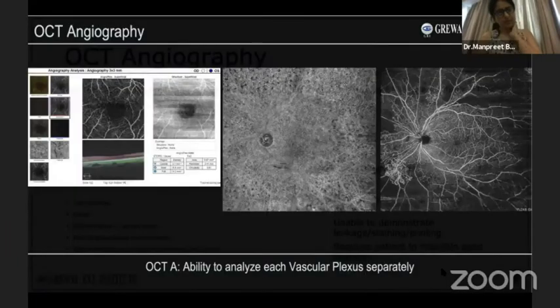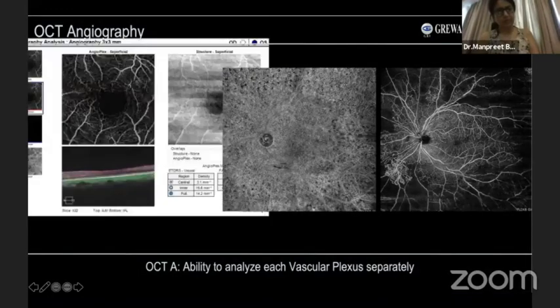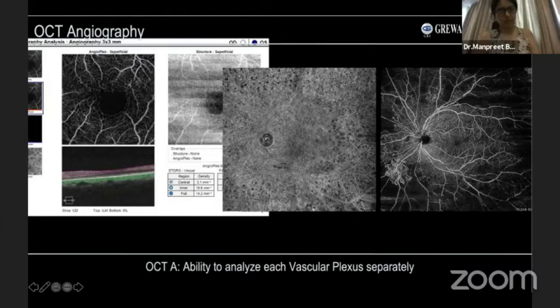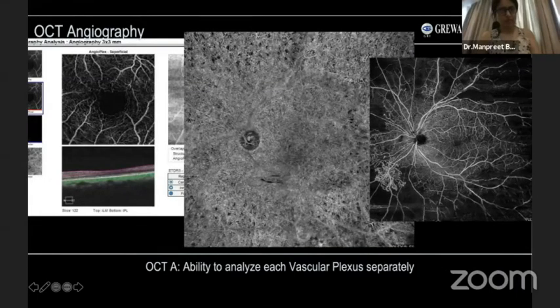The OCTA images are viewed in tandem with corresponding structural en-face and cross-sectional OCT scans. It has the ability to visualize each vascular plexus separately. In a diabetic patient, it is usually the vitreoretinal interface, superficial, and deep plexus that we look at. That is how the image is usually displayed on screen — you analyze the different vascular plexuses, including the choriocapillaris layer.